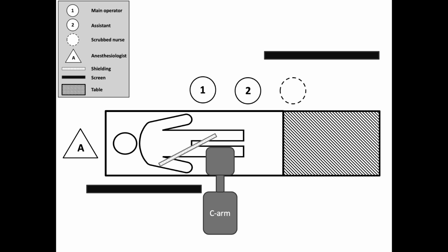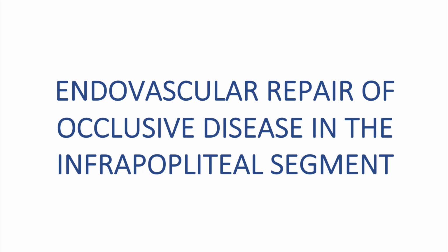B. For right limbs, a left retrograde puncture is used, with the setup shown in Figure 4. The limitation is that operators will need to work with their left hand. An additional screen can also be prepared on the patient's right side for potential retrograde puncture.